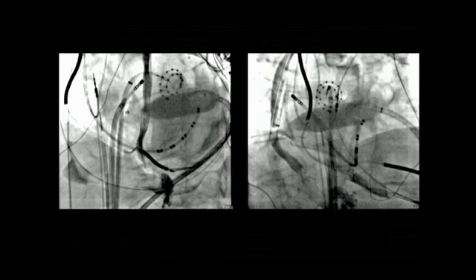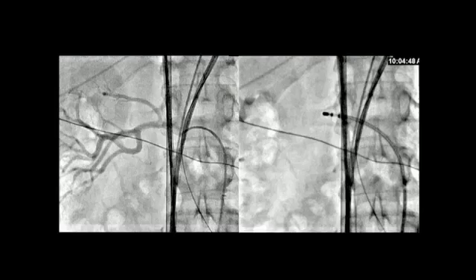we then put in the pericardial balloon for protection of the esophagus, and ablation here was still endocardial, but we were able to, by more aggressive endocardial ablation with the pericardial balloon protection, then remap and show that those areas of survivor myocardium were now scarred and that we had completely isolated the posterior wall. In addition, in this case, we did renal denervation.